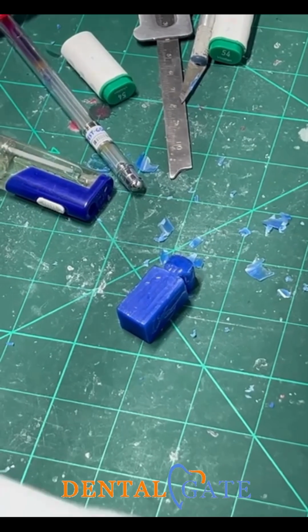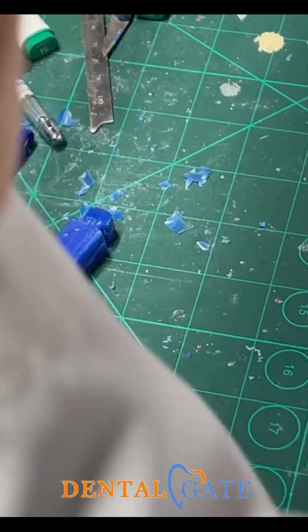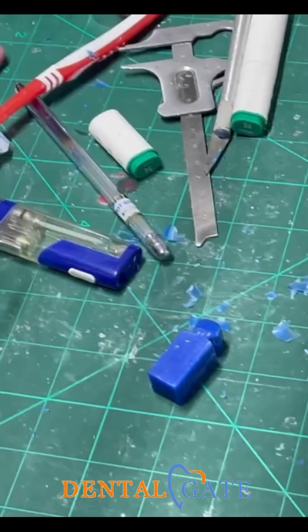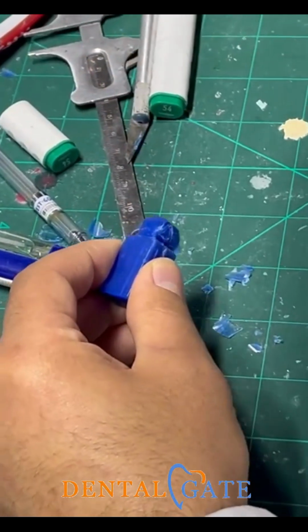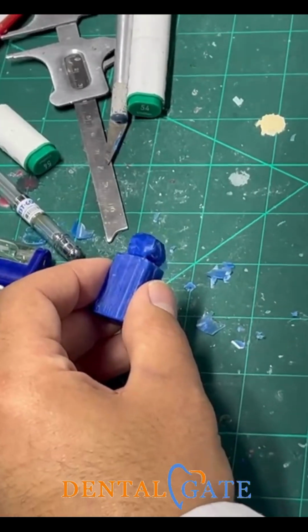After that, I will deal with the light. The shape will influence the shade, the aesthetic. So start with the proper shape. After that, add the features. It will involve the shade, chroma, hue, all features of the aesthetic. It will be added with the proper shape of the tooth. Okay? So this will impact the reflection and absorption. There is no straight aspect. It will not produce the same aesthetic as the curved one.